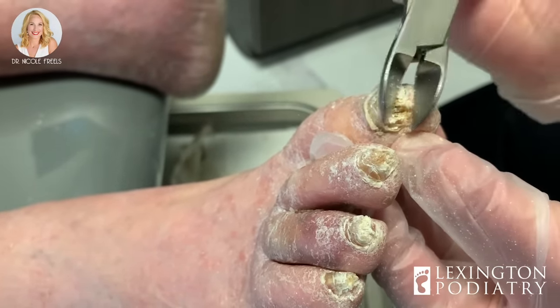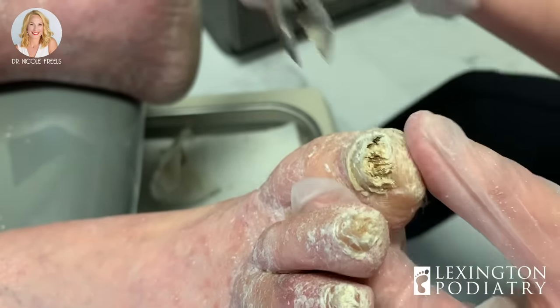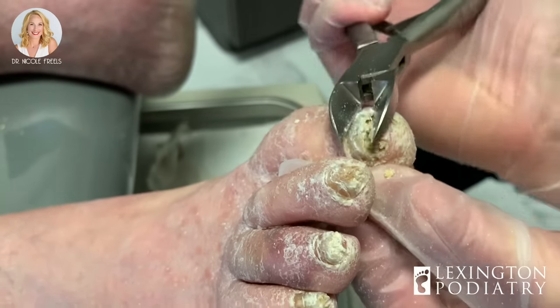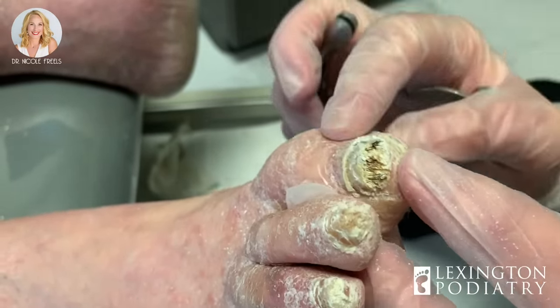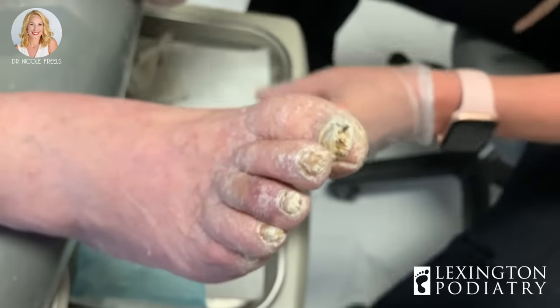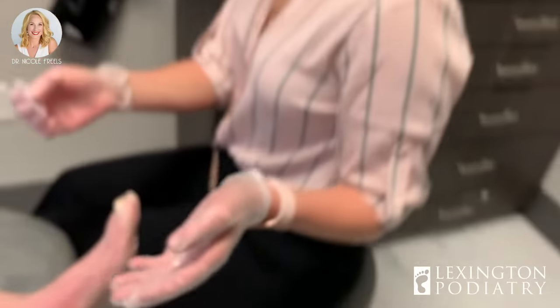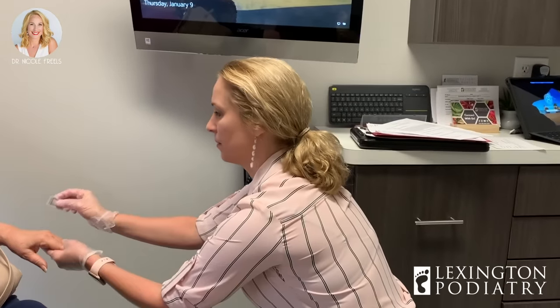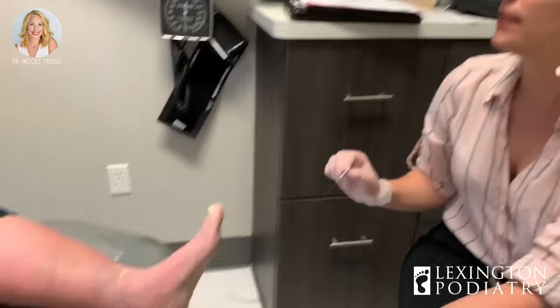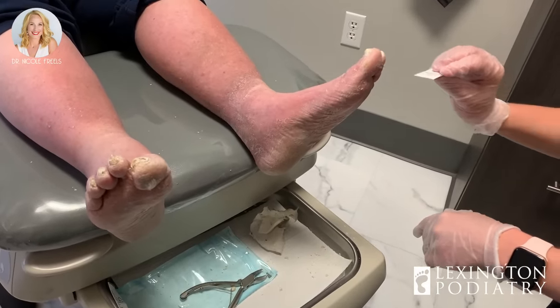Okay, so far so good. I think I'm going to dremel the rest of that one — got quite a bit off. On the next visit when she comes in we'll be able to get even more. Okay, I'm going to do the monofilament test just to check your neurology. If I can have your hands — that's normal. I'm going to touch a couple of places; you let me know if you can feel it, and if it's sharp, dull, or the same. Close your eyes.